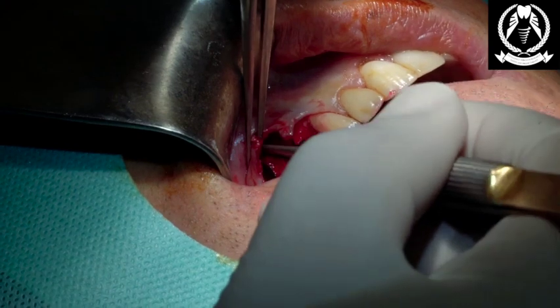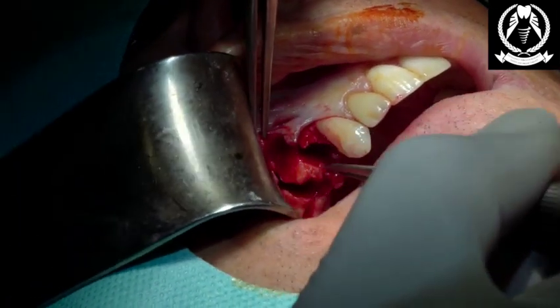You want a bite block? We can do with a bite block, it's fine. No, I think I'm okay.